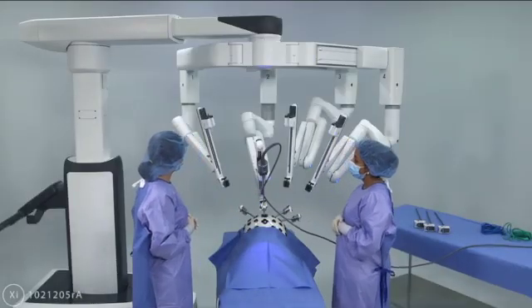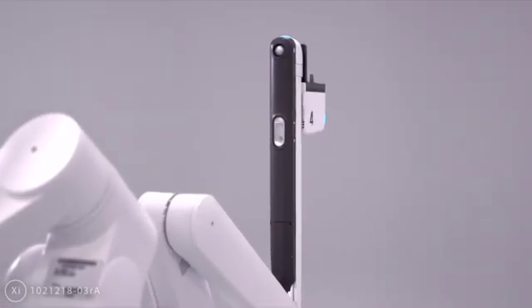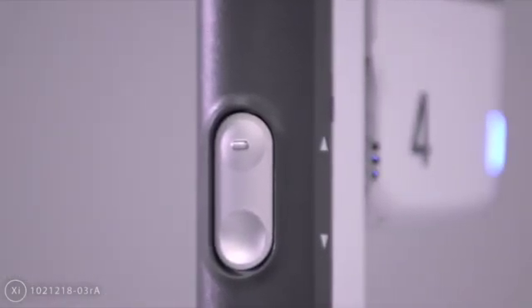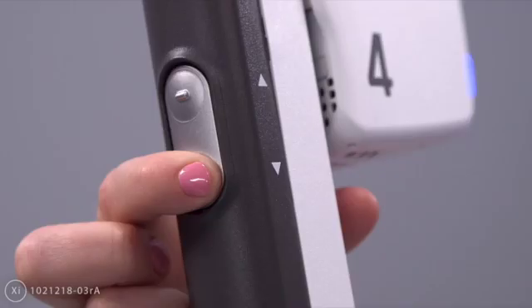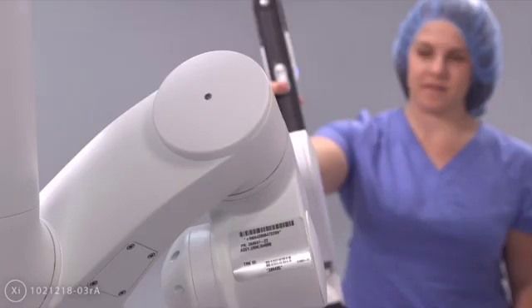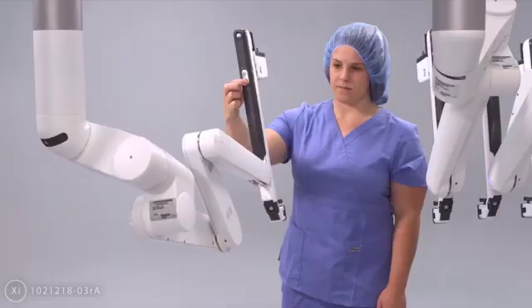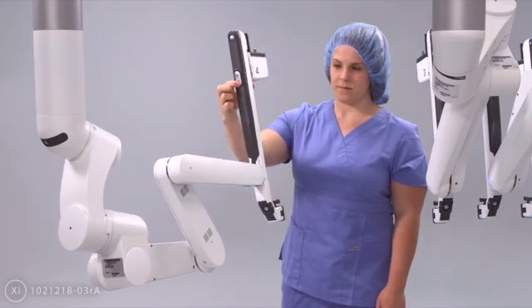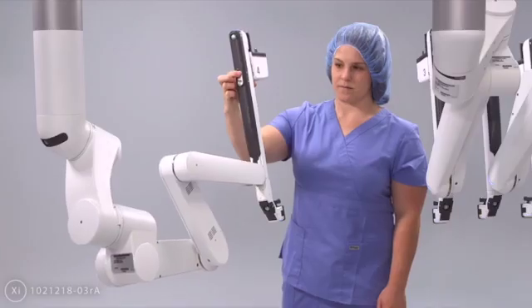Next, the rest of the arms can be docked and positioned. Patient clearance is adjusted by a pair of buttons located on the gray portion of each arm. Sterile staff can use patient clearance to adjust instrument reach as well as patient clearance. Pressing the down arrow rotates the patient clearance joint lower to help optimize instrument reach. Pressing the up arrow rotates the patient clearance joint higher, providing more patient clearance.